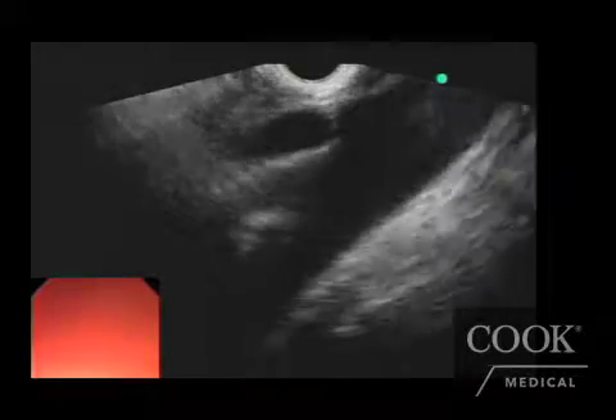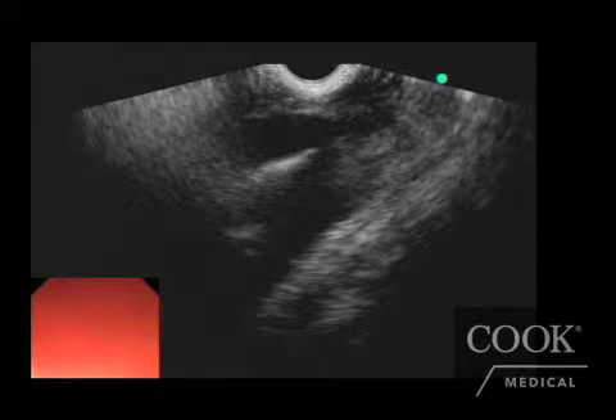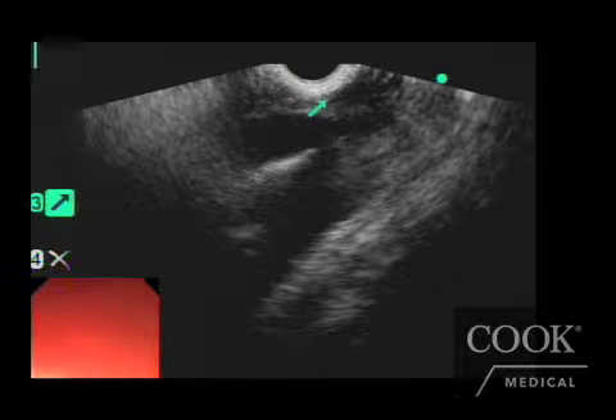To confirm further, it will be nice to demonstrate the superior mesenteric artery. As you can see in this image, back to back — this way you are sure that you are performing the celiac neurolysis in the right area. You'll see the celiac artery in this area; the superior mesenteric artery is here.